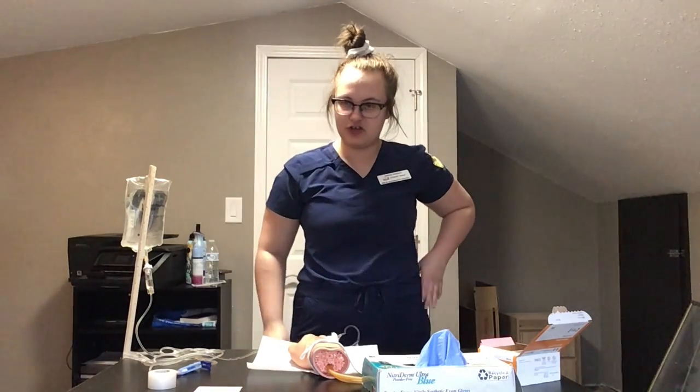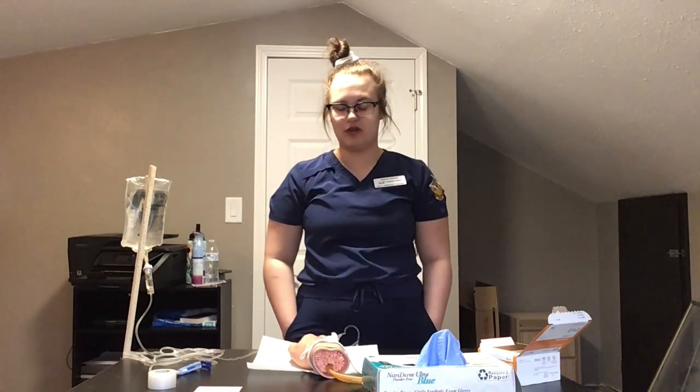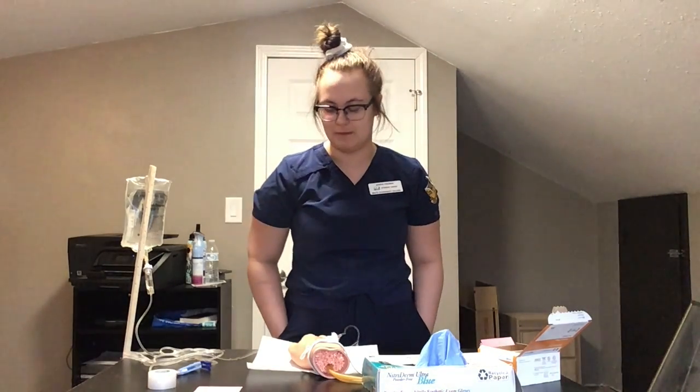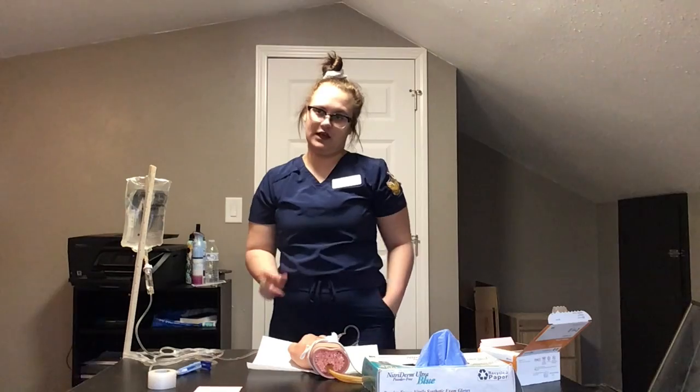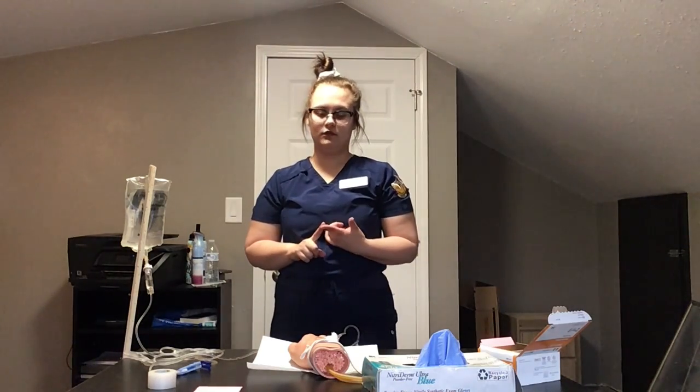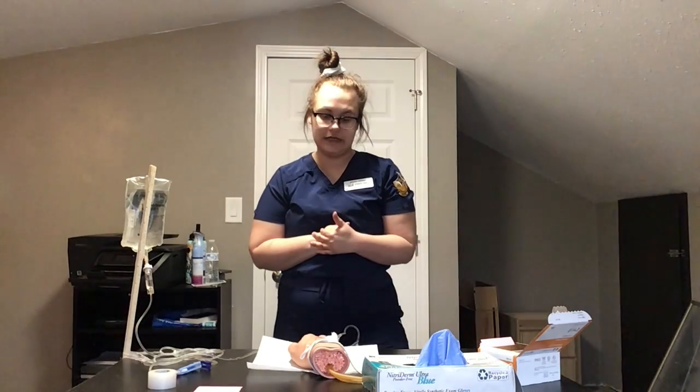I would talk to the patient, make sure he or she is feeling alright, that they're tolerating the procedure well. I'm going to establish the infusion rate as ordered by the physician in the MAR. And then dispose of everything. Then I'm going to document everything, how the procedure went, what conditions I did them under, and how the patient tolerated the procedure. And that is that.